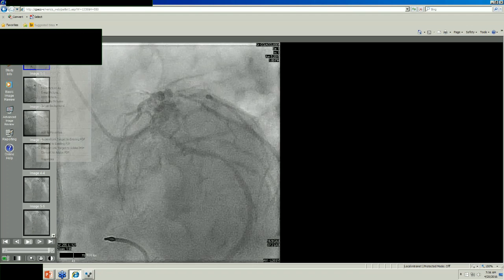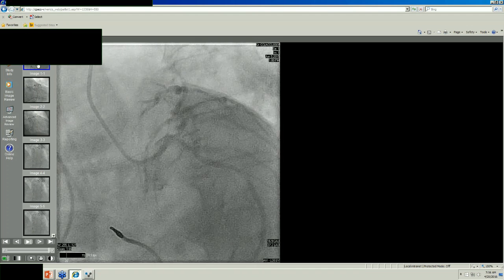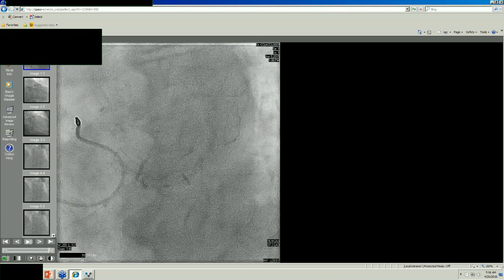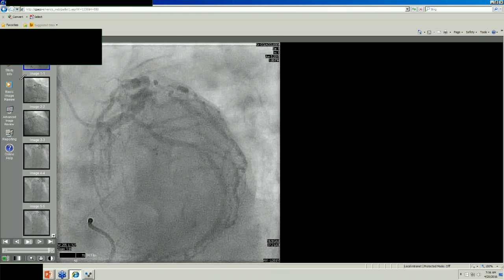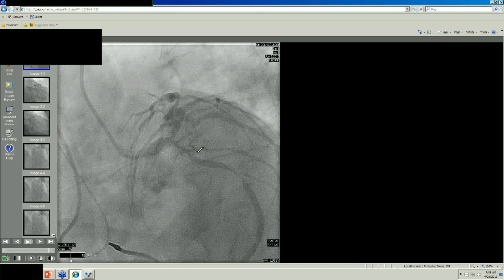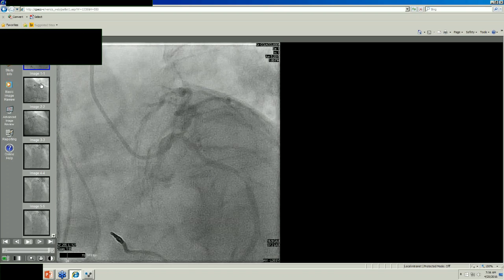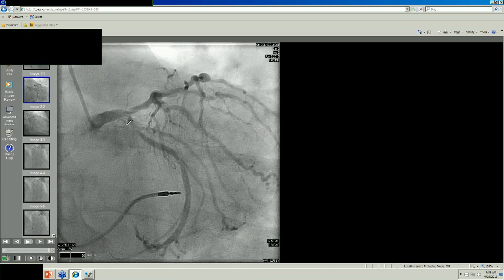So we take a look at this guy's vessels and see what we can learn from this one. We'll start with here. Now, this is a distal main left again. We're not dealing with ostial main left disease, because you're going to learn that ostial main left disease is more dangerous in the cath lab because you jam a catheter in there and then you inject toxic material that doesn't carry oxygen. But let's look at this, and there is some narrowing here in the main left.